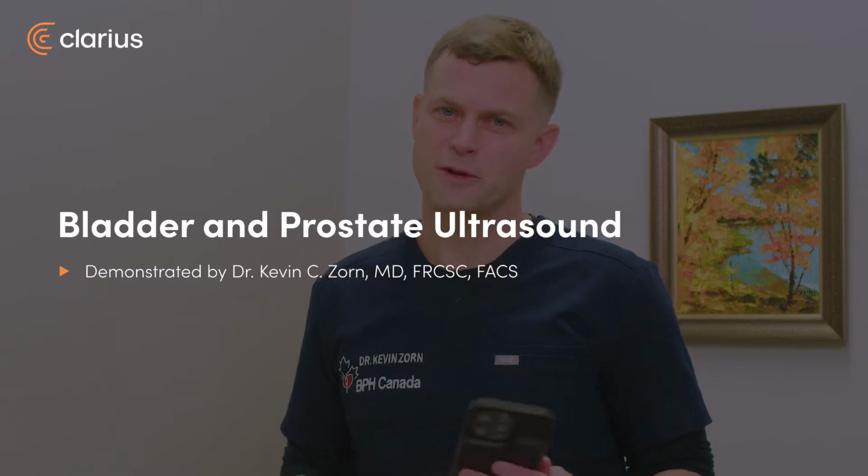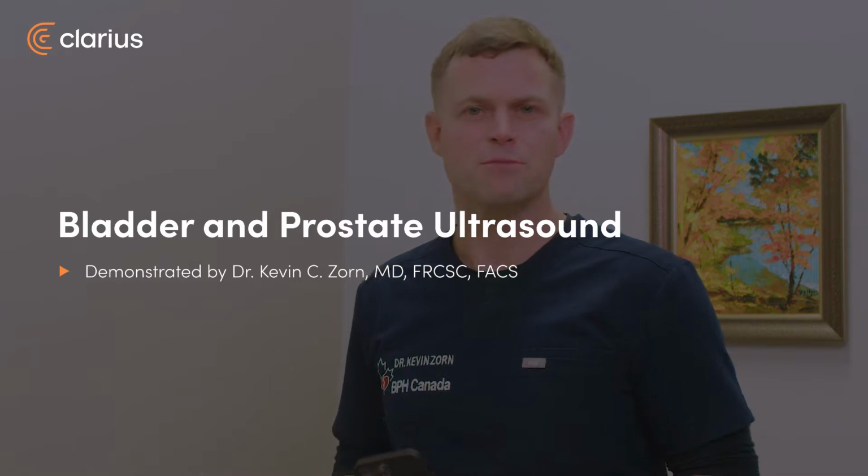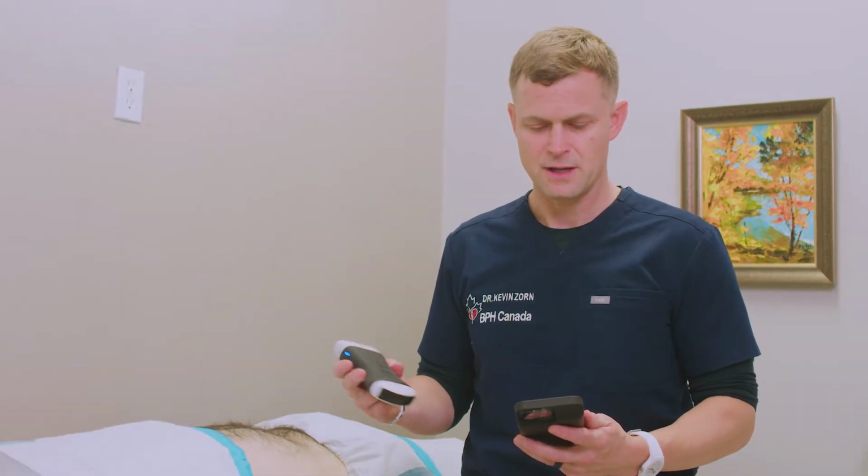Hi, I'm Dr. Kevin Zorn, and today I'll be performing a Clarius ultrasound for my patient, looking at his bladder and his prostate to evaluate his lower urinary tract symptoms. So I have the C3, the small curved array, third generation Clarius system, and I'll be linking up now to my Clarius app on my iPhone to have the pre-programmed prostate settings, so it will best discriminate the tissues around the bladder and the prostate.